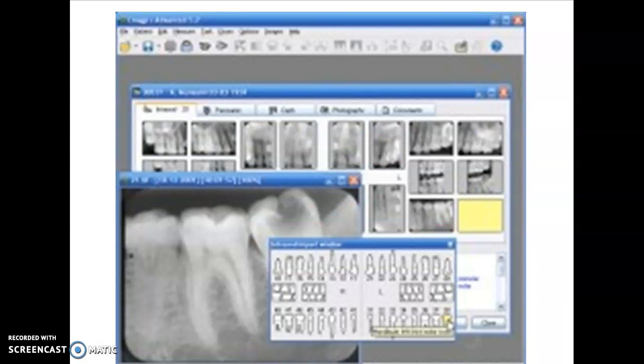Again, this is blurred out just to keep patients' names from being shown, but just as an example, I wanted you to be able to see the little toolbars and different things that are available. Say the patient has come in and they want tooth number 17 to be worked on or looked at. So they bring the patient in, and the dentist is able to pull up the patient's chart, look at the tooth, look at any notes that they have about the tooth. When they click on it, it automatically pulls up radiographs, specifically any radiographs they have of that same tooth. And you can see here, even with it blurred out, you can see the decay and the detail that would have been present.